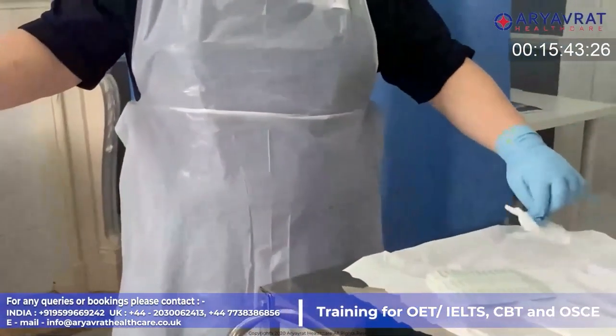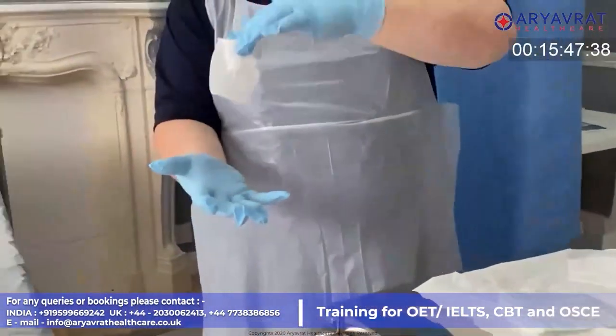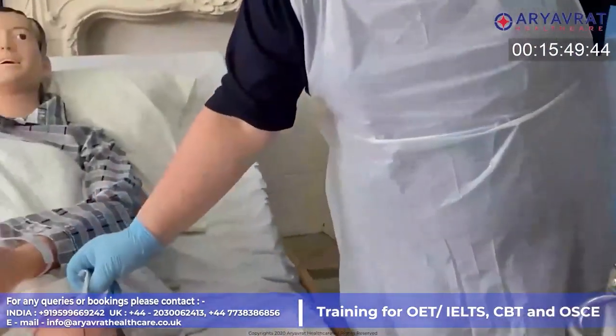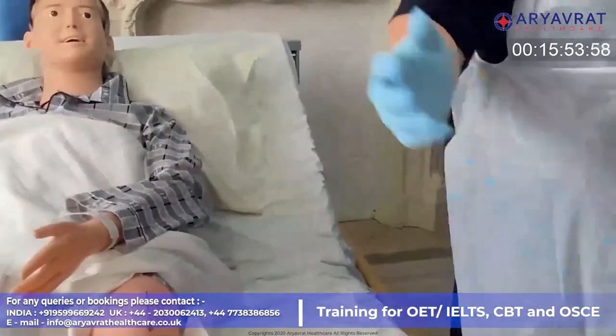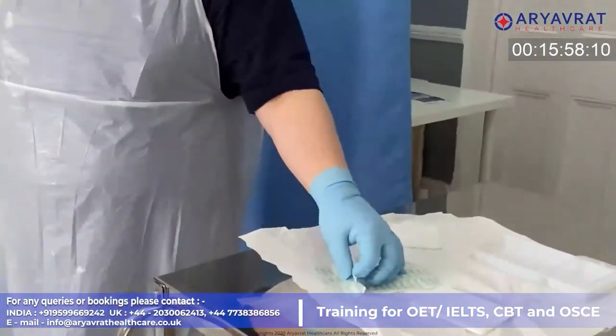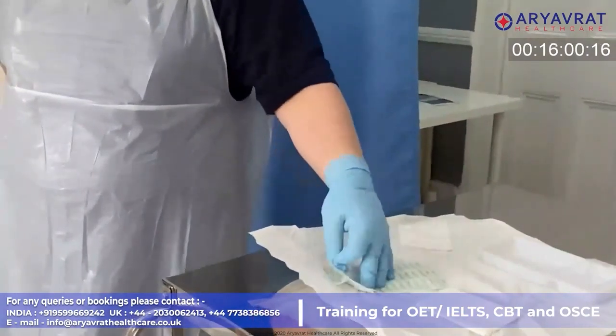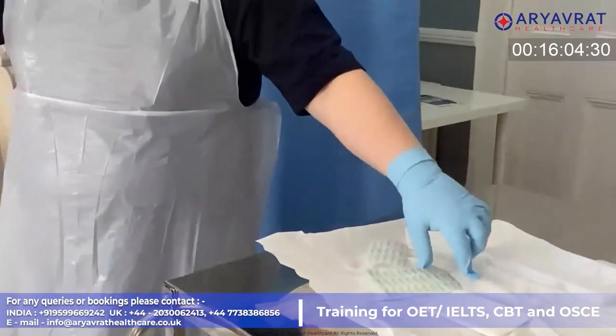Then I'm going to take a dry gauze, which I am going to dry. Now, with my clean hand, I'm going to pull half of the backing of the dressing off.